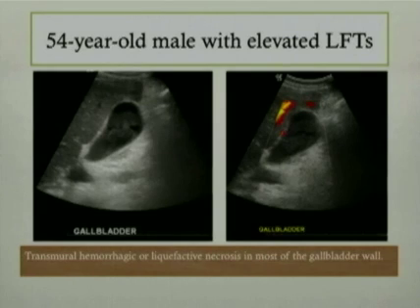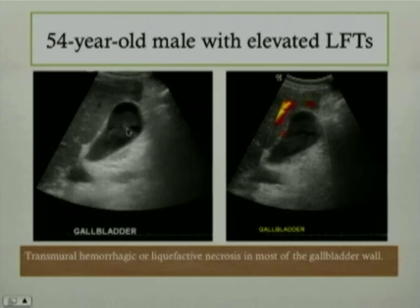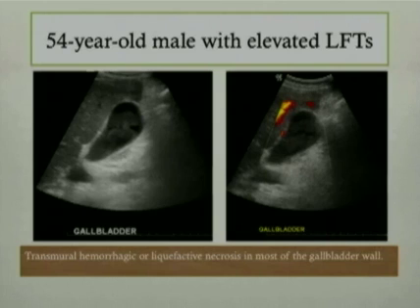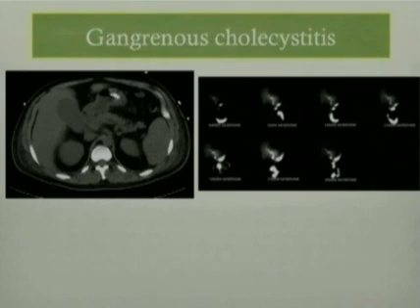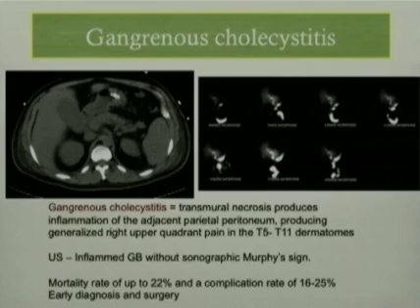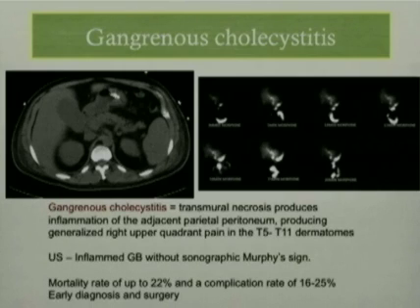Moving on to the next case — a 54-year-old male who presented with elevated liver function tests. The two gallbladder images demonstrate an avascular area within the gallbladder lumen that some may call sludge, but the gallbladder wall is not well defined, and the sludge does not layer dependently. This actually was transmural hemorrhagic necrosis involving the gallbladder wall, diagnosed as gangrenous cholecystitis and proven surgically. Gangrenous cholecystitis involves transmural necrosis producing inflammation of the adjacent parietal peritoneum and generalized right upper quadrant pain. Ultrasound demonstrates findings of an inflamed gallbladder but without sonographic Murphy's sign.